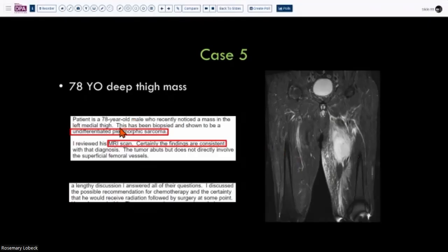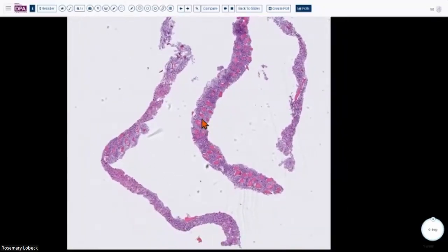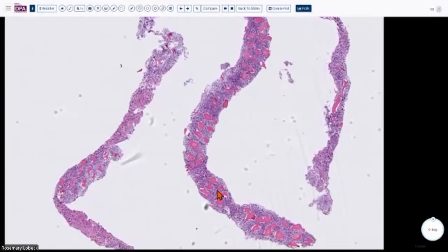So it was biopsied, and it was actually called an undifferentiated pleomorphic sarcoma. And then the surgeon sees this and says, I reviewed the MRI scan as well. I looked at the biopsy, and certainly the findings are consistent with the diagnosis, right? And they are discussing chemotherapy and radiation therapy. So let's see what this biopsy actually showed. Here we see a very cellular lesion, and all the pink blobs are the skeletal muscle bundles. So the skeletal muscle seems to be infiltrated quite diffusely by this highly cellular lesion.